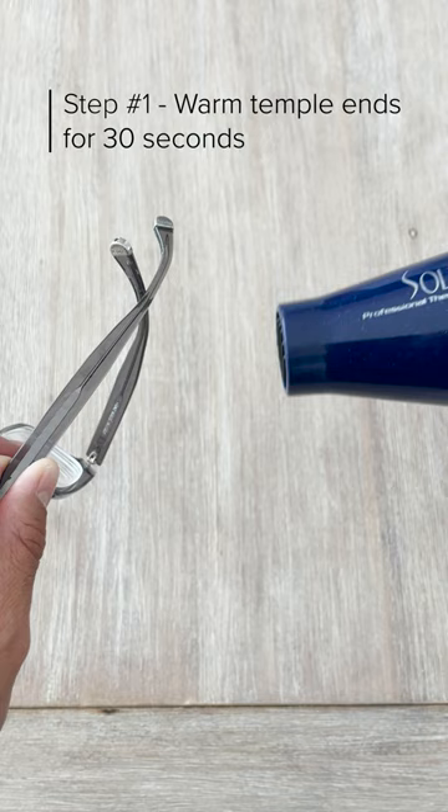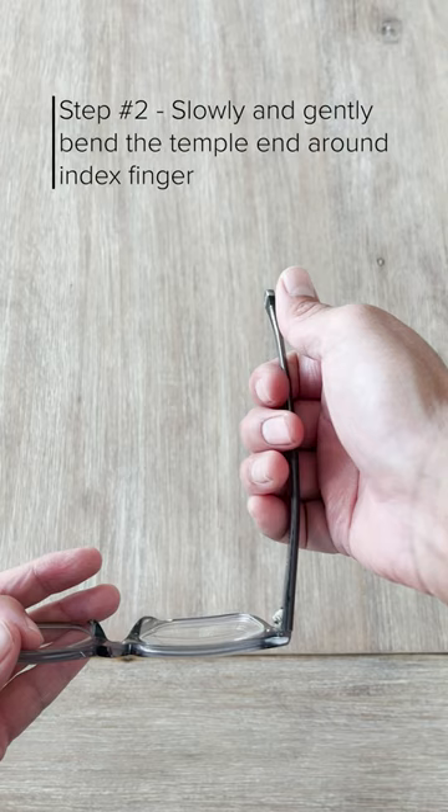First, warm the temple ends for about 30 seconds. Next, place your hand around the arm and position your index finger at the bend of the temple. Then, use either your other hand or thumb to slowly and gently bend the arm.